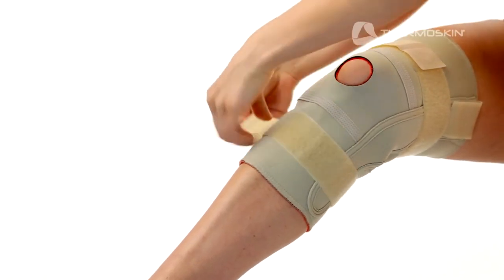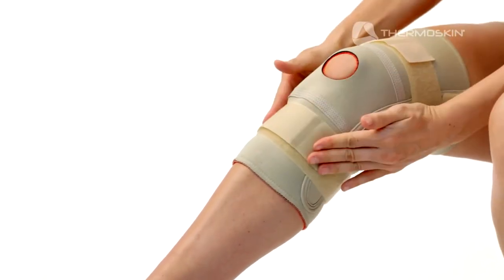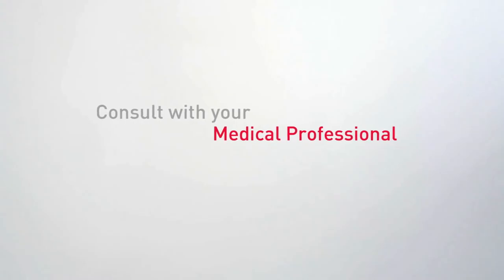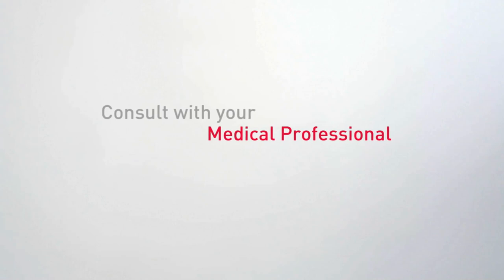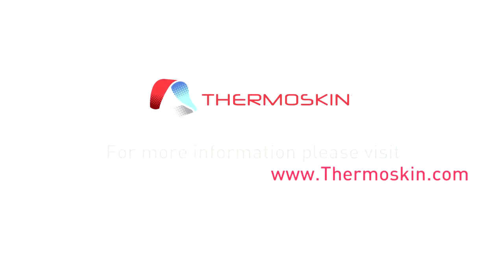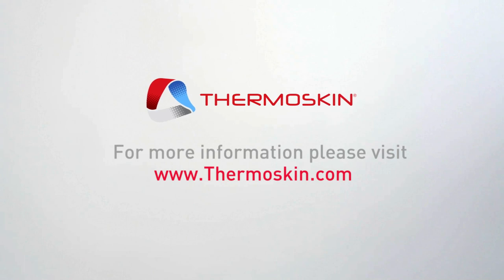Next, thread the lower strap behind your leg, through the lower buckle and back on itself, securing the fastener to keep the brace firmly but comfortably in position. If pain persists, please consult with your medical professional for a complete diagnosis and treatment plan. It is important to use the correct size to achieve the maximum product benefits. For more information, please visit thermoskin.com for sizing guidelines, color options, and other products in our range.